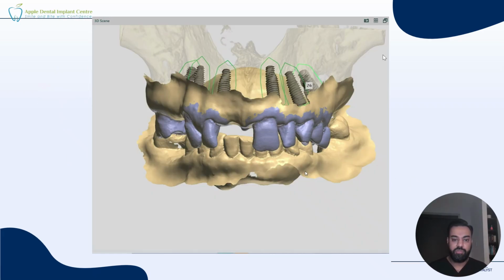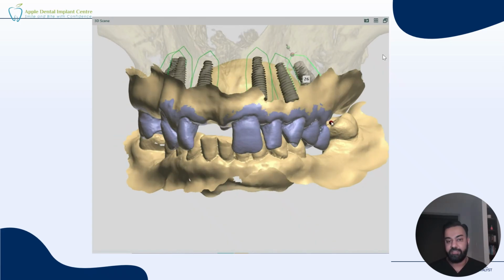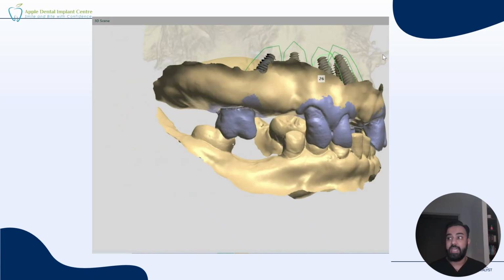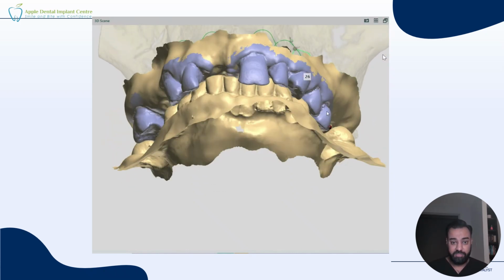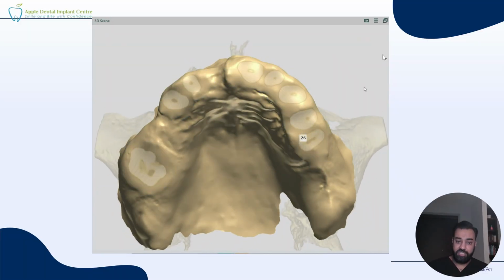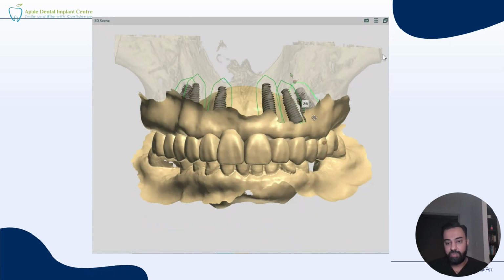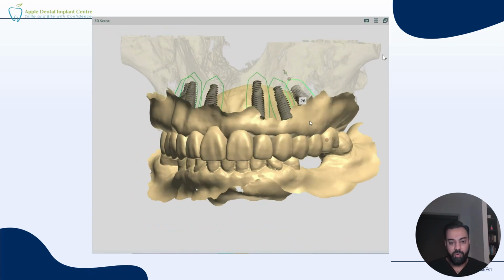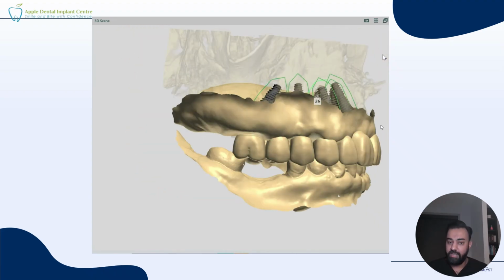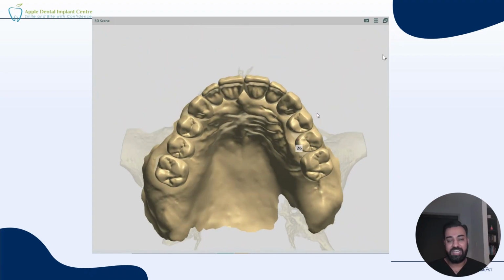This constitutes a smile design for us. This is how I was designing the case. These are my tentative implant positions. They're not set in stone because I don't know what my situation would be when we go intraoperatively if my situation changes. So we remove the teeth. We look at the bite. We overlay with a proposed treatment plan of how the teeth could look like. Now, this is considering his current vertical dimension.